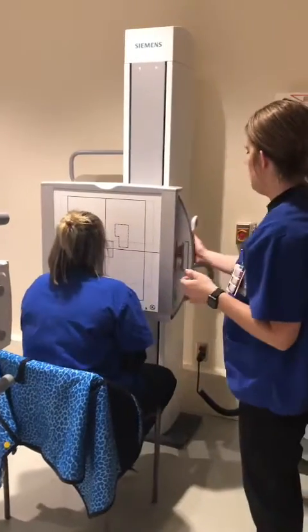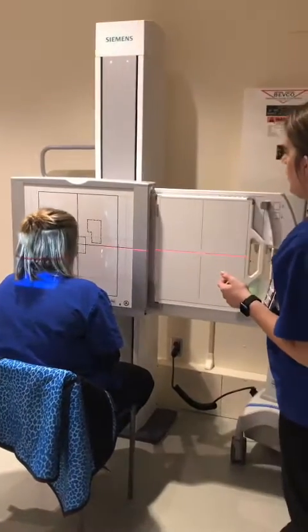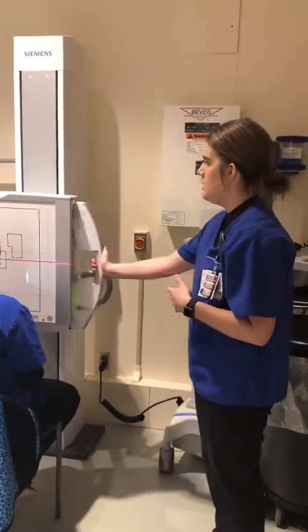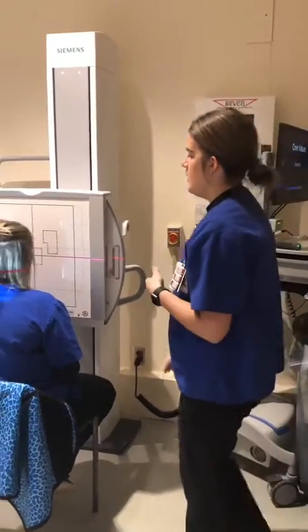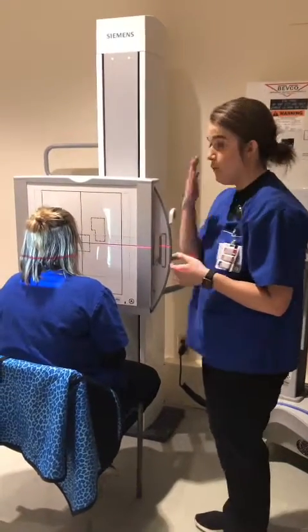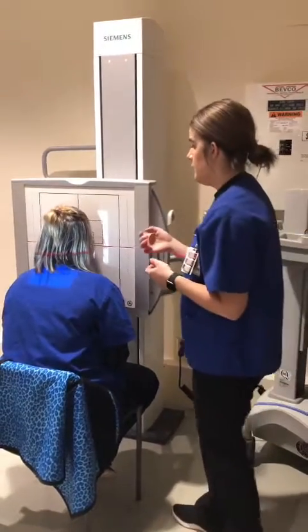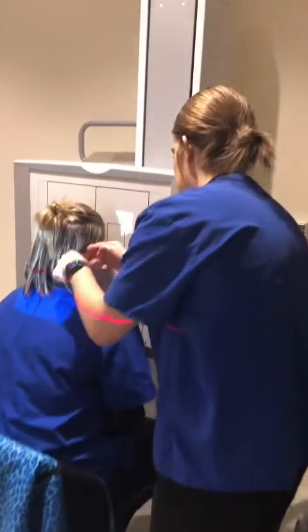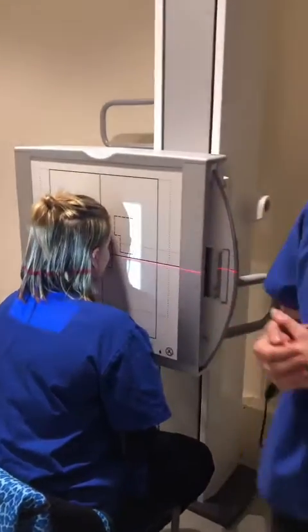Alright, so I have my image receptor lengthwise in a wall Bucky. I'm going to stick this back in here. So with the PA Caldwell skull, I'm going to have the patient put her forehead and her nose up against the wall Bucky here. And I want her OML, her orbital meatal line, to be perpendicular to my image receptor.